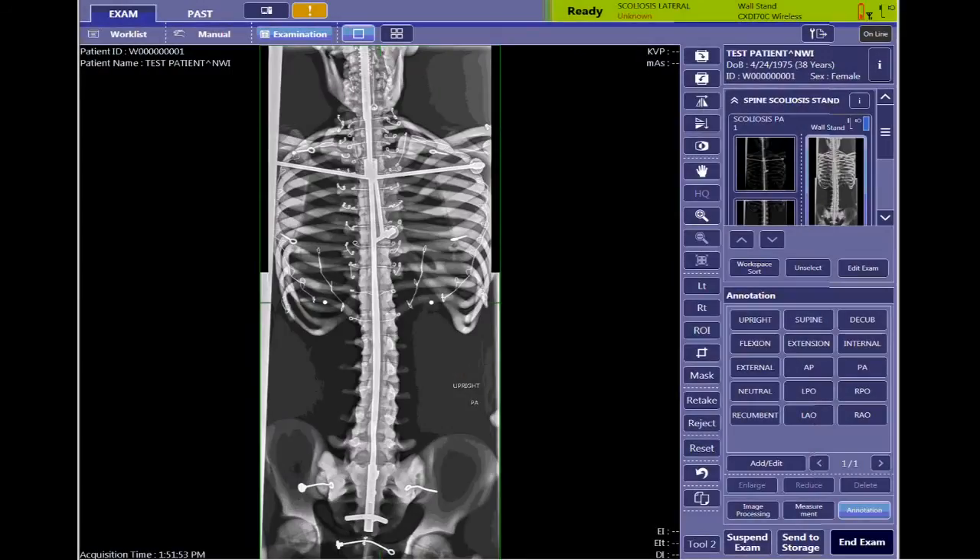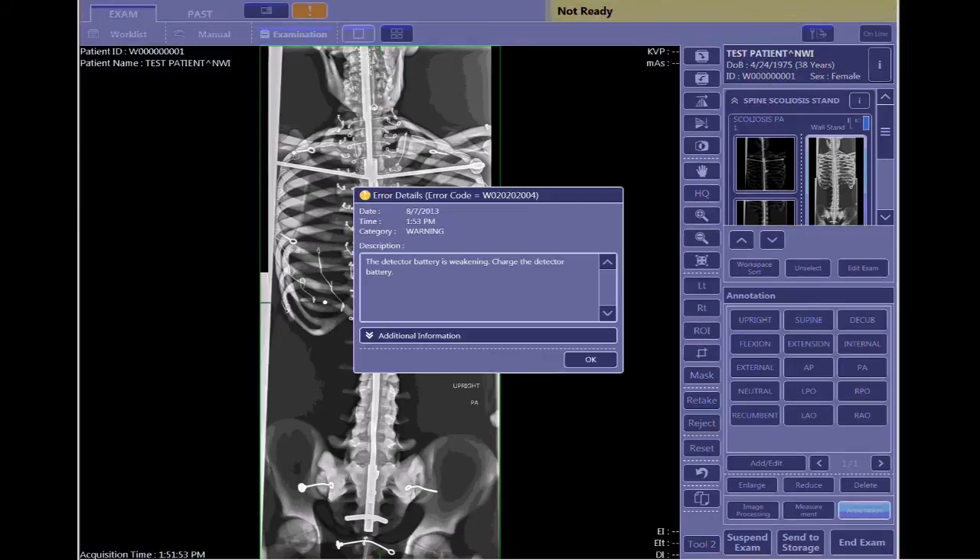Just a quick note: also notice that at the top here, I'm getting a flashing red battery and an exclamation point. If I click on that, it's going to tell me that my detector battery is weakening and that now is the time to change the detector. It's always best to wait for the system to tell you to change batteries, so now is a good time to do that.